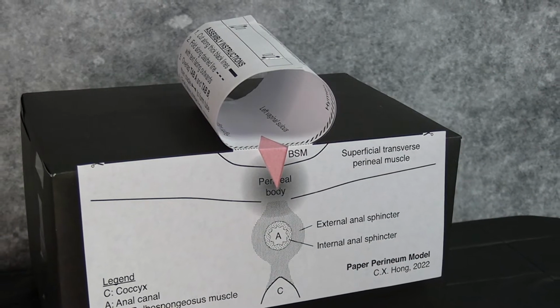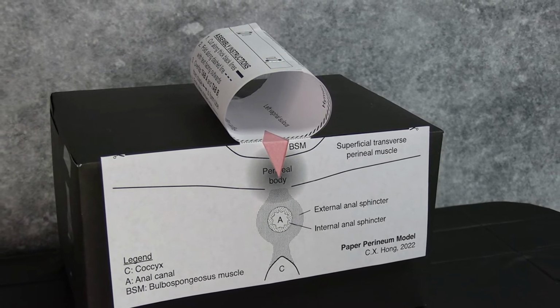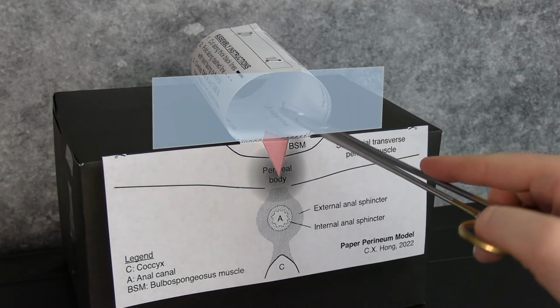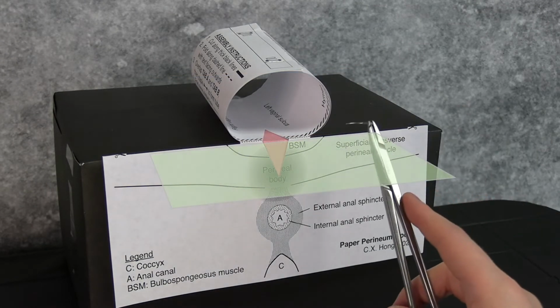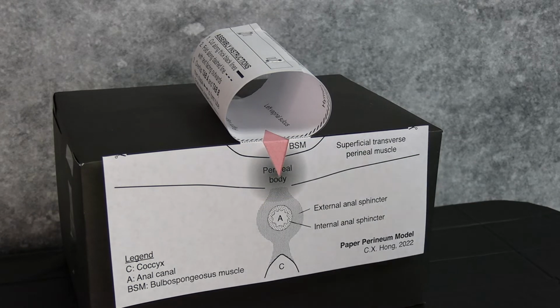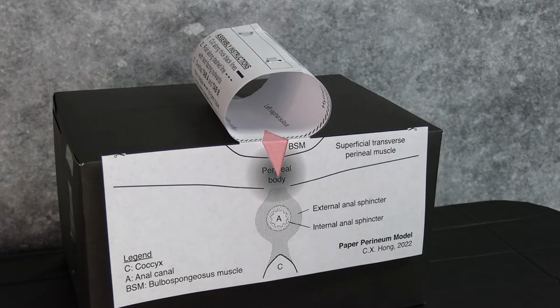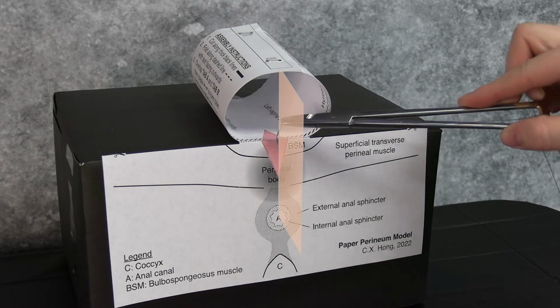In this example, the model is used to demonstrate differences in suture path between vaginal and perineal portions of laceration repairs. In the vaginal portion, the suture path is in the axial plane. In the perineal portion, the suture path is in the coronal plane. A crown stitch, often performed as the transitional stitch between the vaginal and perineal portions of a laceration repair, can be demonstrated as a stitch involving a suture path in the mid-sagittal plane.